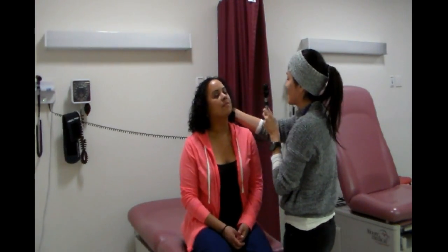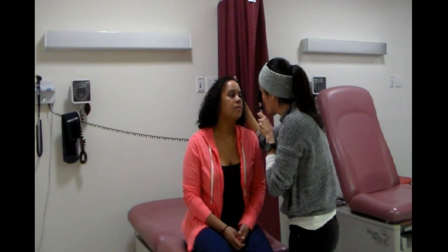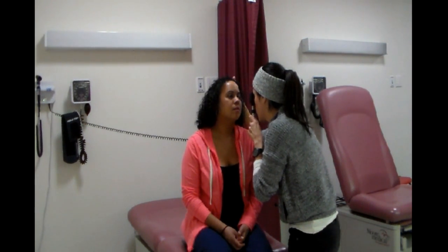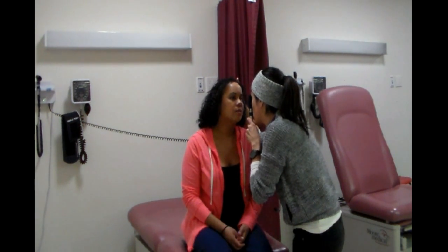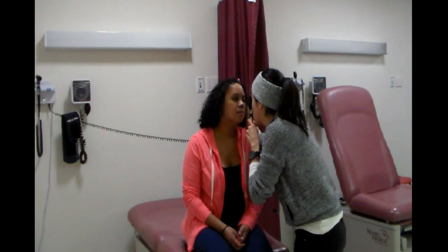We're gonna see the same thing on this side. We get pretty close again. Again, red reflexes. I don't see any opacities in the back of the eye. I don't see any nicking. I see the retinal arteries are red, and the optic disc is pink.